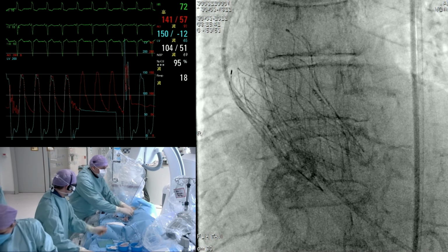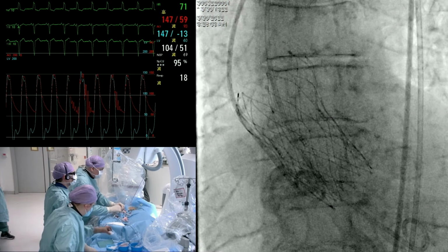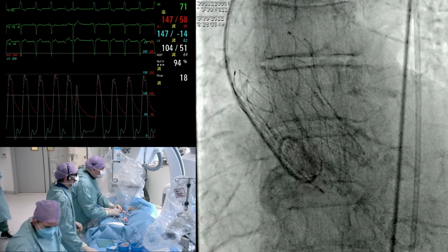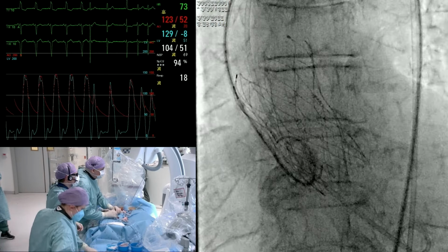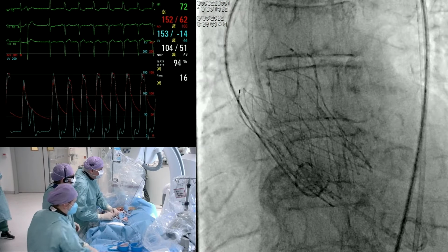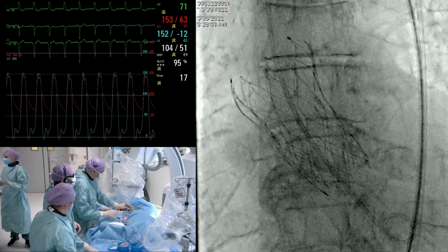I left the pigtail here in the non-coronary cusp during the final deployment, just to make sure we had a good understanding of what happened to the valve. So it's often not a major issue. You can just go in here with a standard guide wire, push a bit on the wire, and then slowly come back with your pigtail. Yeah, I agree. It's good to have that reference point. You use it as your reference during the entire valve deployment, even with the release. I also prefer to keep it, and then indeed, as demonstrated here, you have to use your wire to release it. Yeah, that's perfect.